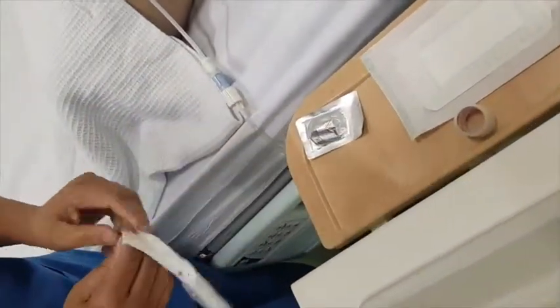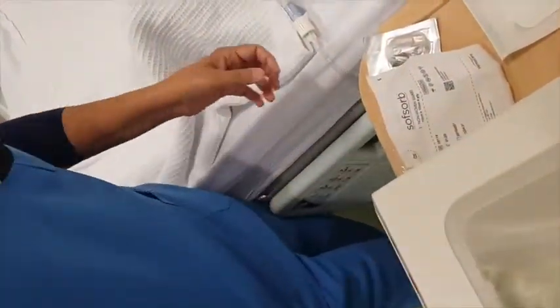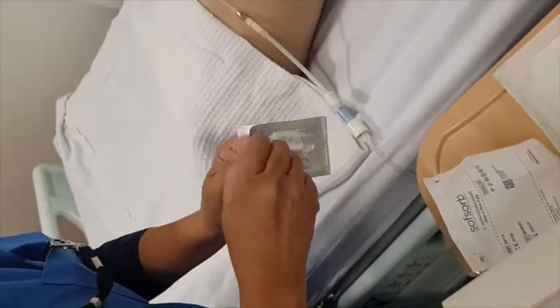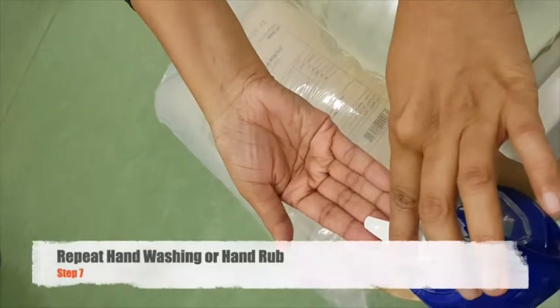Make sure that you open your supplies in a clean area and that the location will be accessible to your patient. After this, you can proceed to do your hand hygiene. You may opt to do your hand washing or your alcohol-based hand rub.